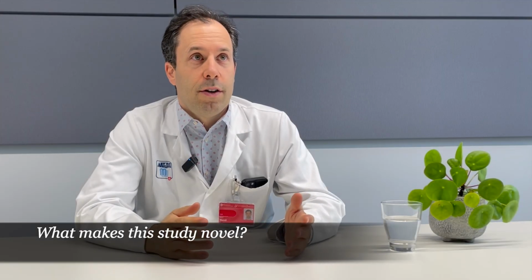This builds on a previous study that we published about 1.5 years ago, where in a small cohort of myositis patients with ILD, we were able to show that FAPI PET-CT, this new technique, is able to distinguish between patients who are more likely to have progressive disease versus those who don't.